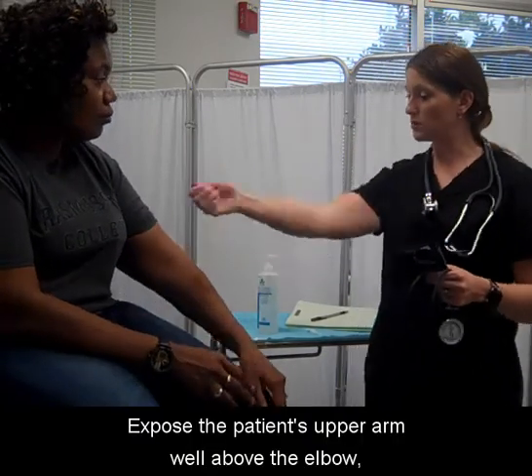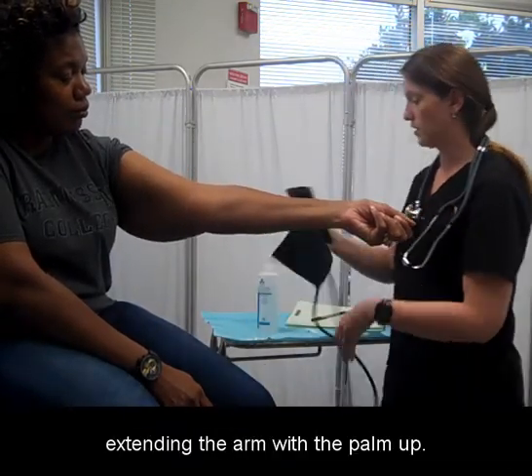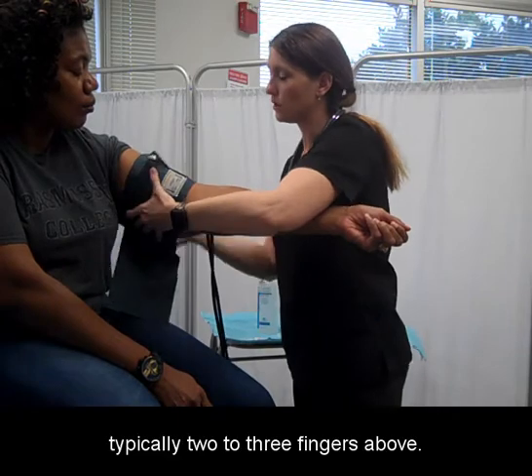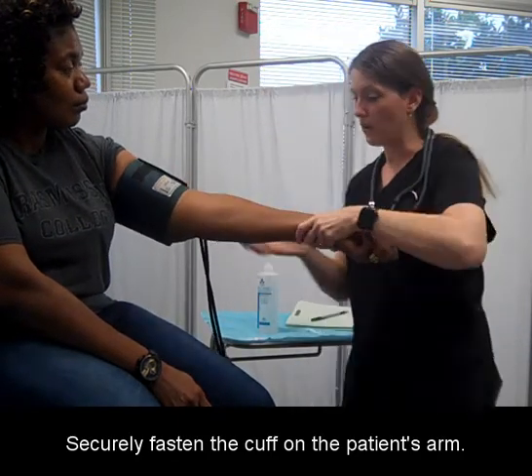Expose the patient's upper arm well above the elbow, extending the arm with the palm up. Place the cuff above the brachial artery, typically two to three fingers above. Securely fasten the cuff on the patient's arm.